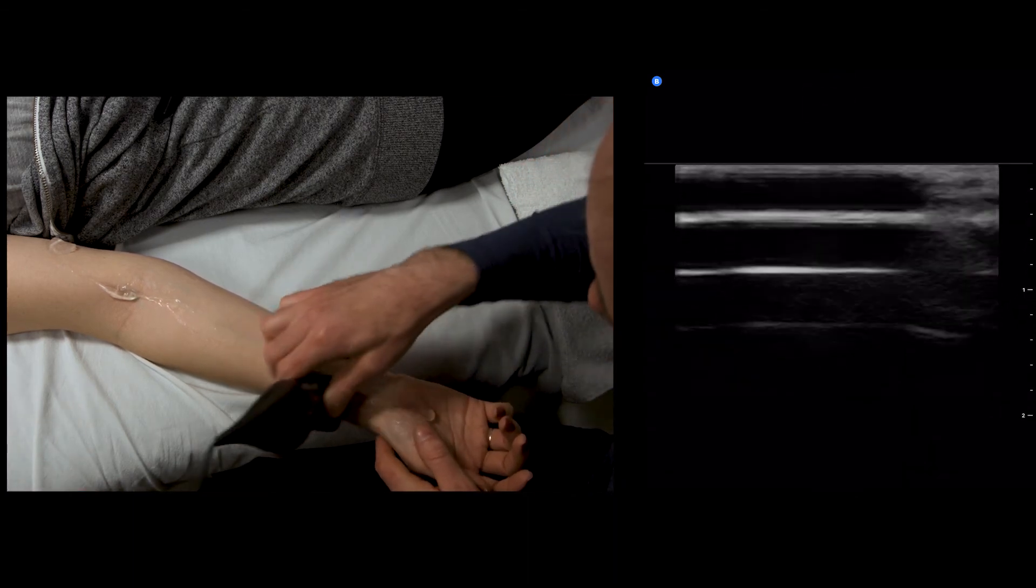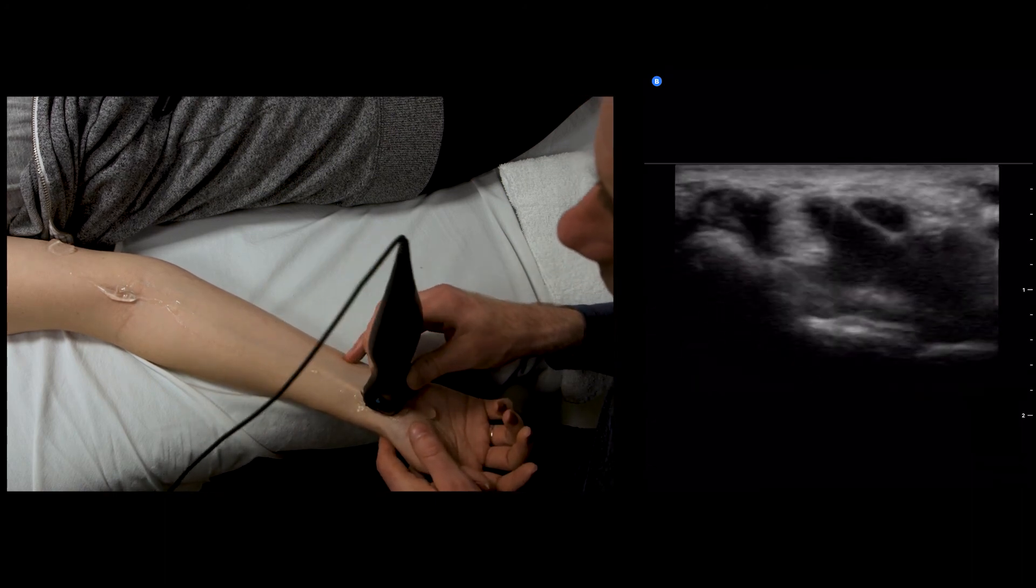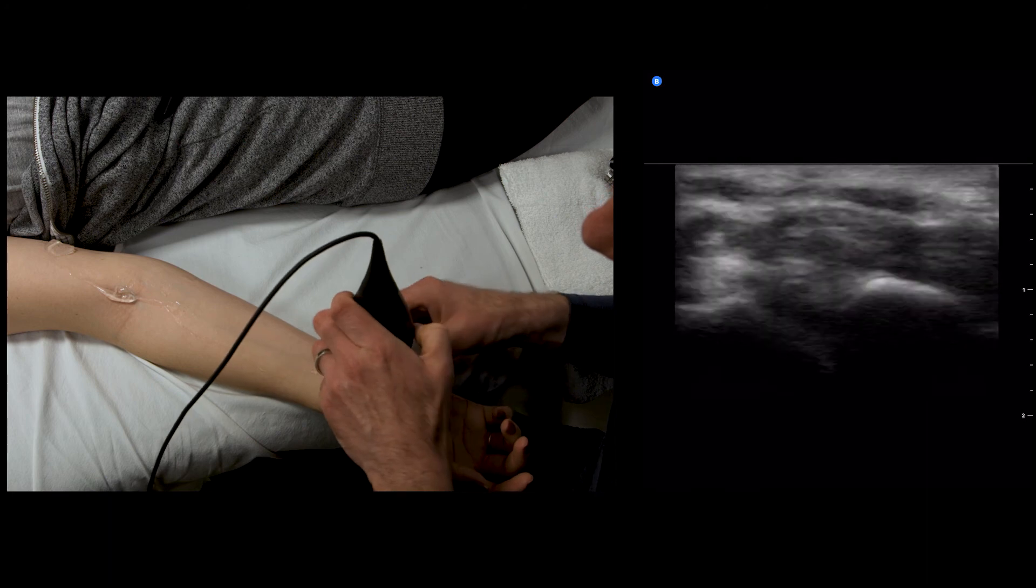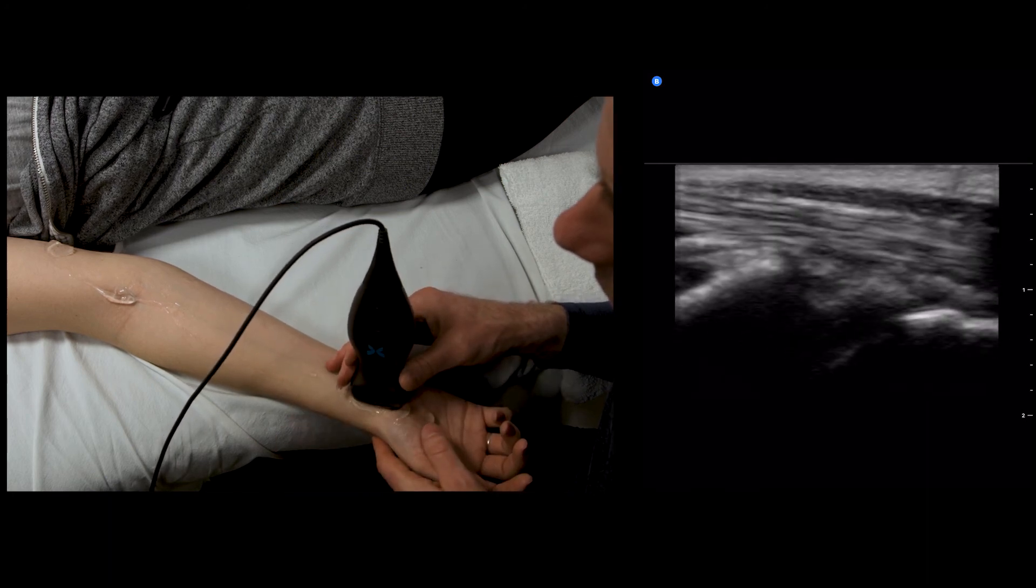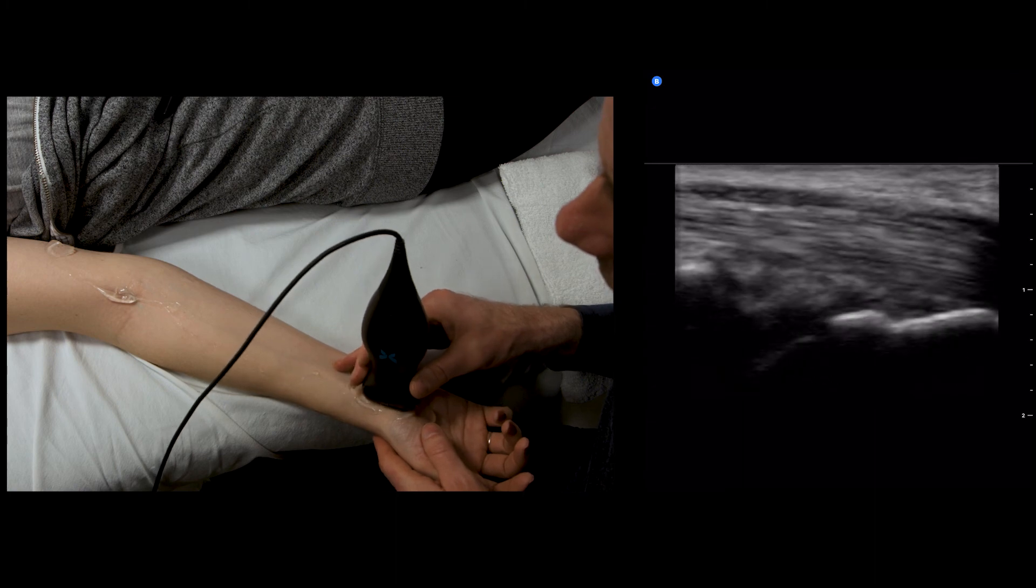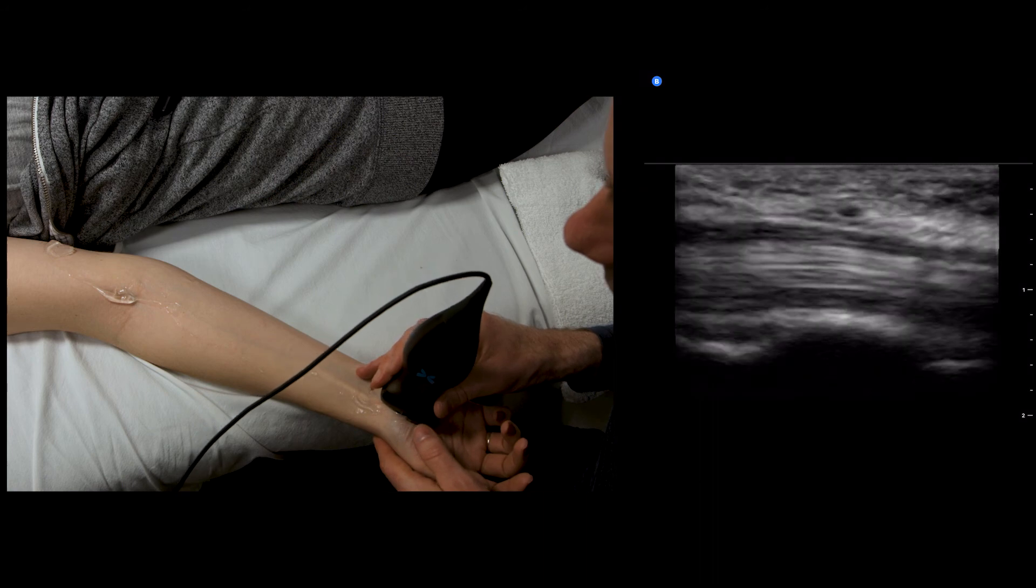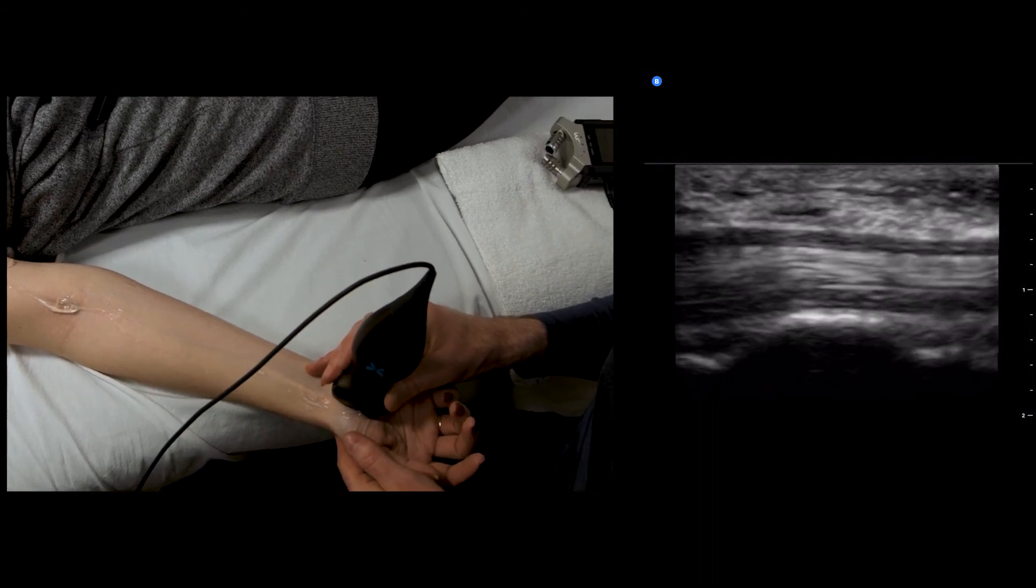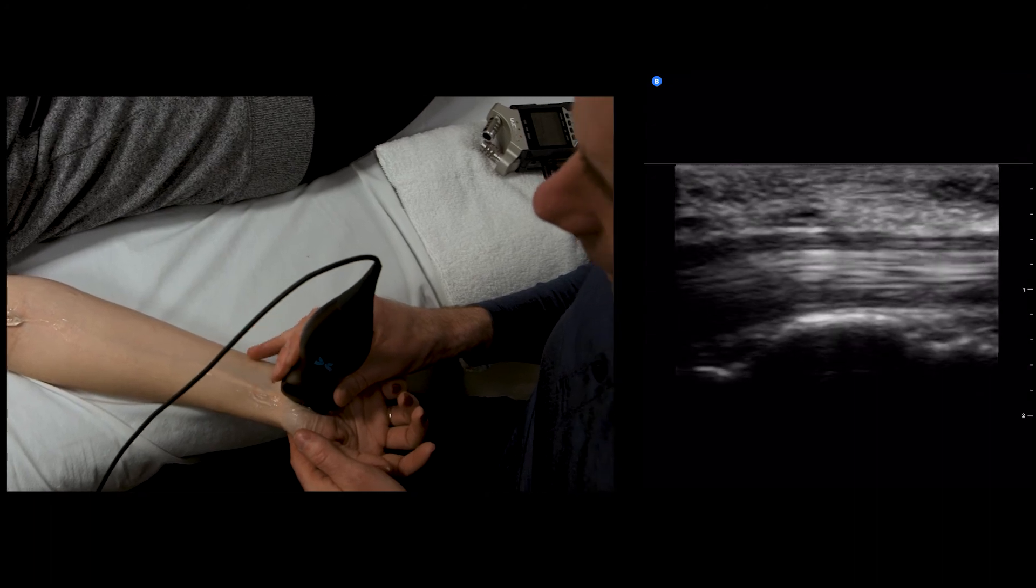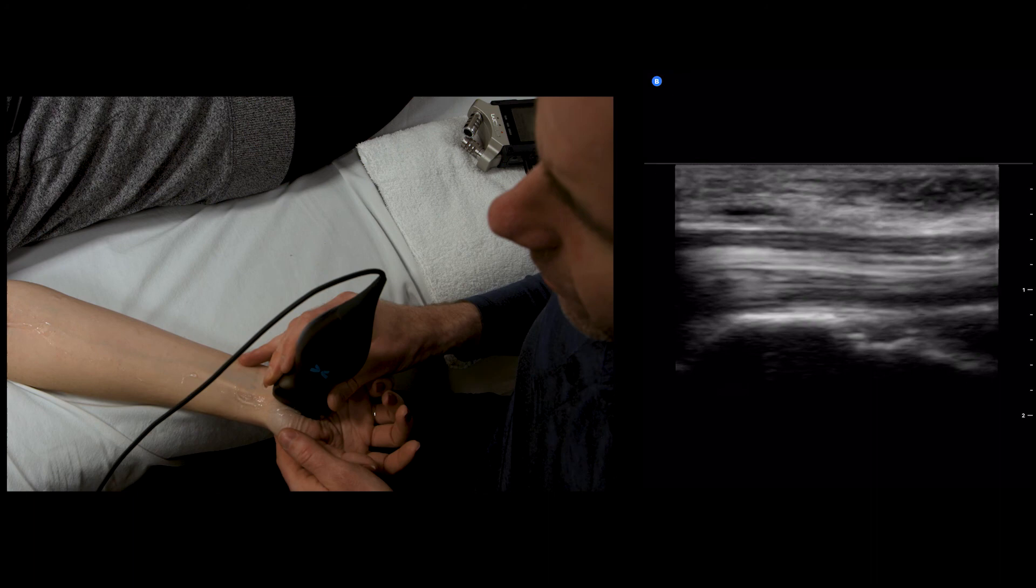The carpal tunnel—I do give it a bit more depth again. And if we look at the nerve now in the long axis here, we can see that it is diving. Accordingly, what we need to do is make it look flat so we can have excellent visualization of the nerve itself.